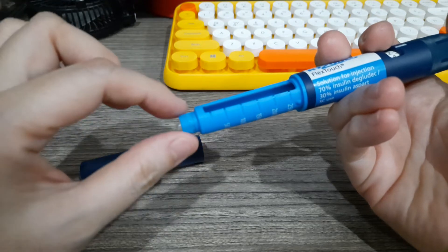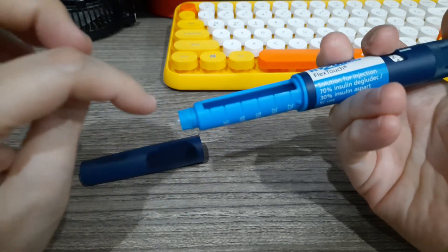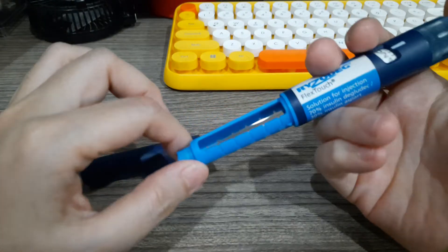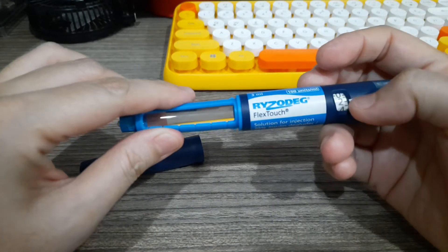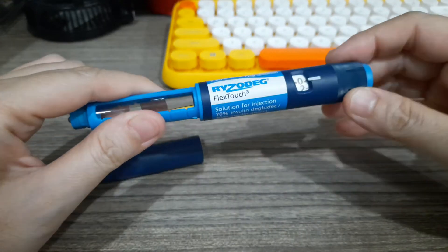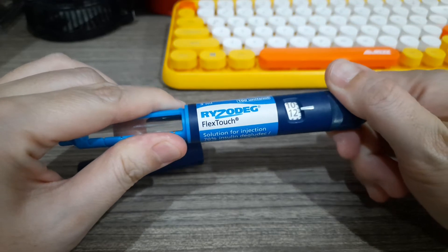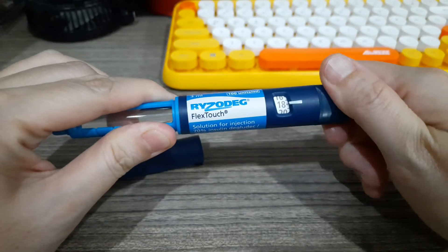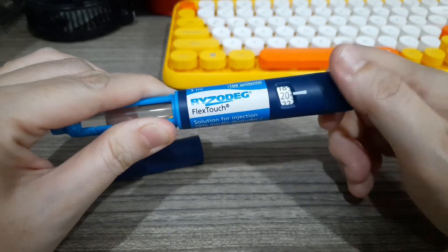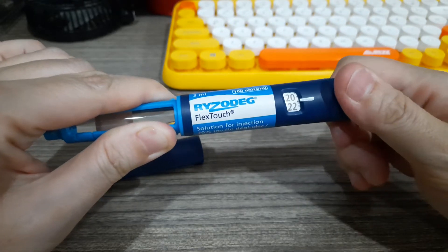That tiny dot means the needle you put is patent, so it will release insulin. The number will go back to zero, and that's when you proceed to dial the desired dose. Let's say your physician says 20 — one click is one unit. If you make a mistake, just turn it back — it's okay.